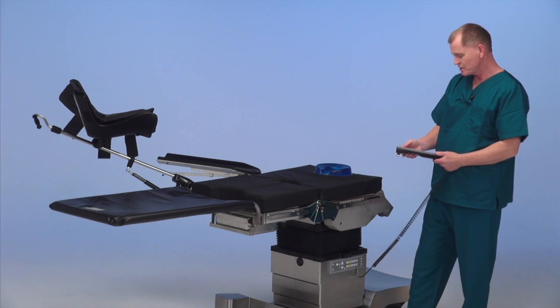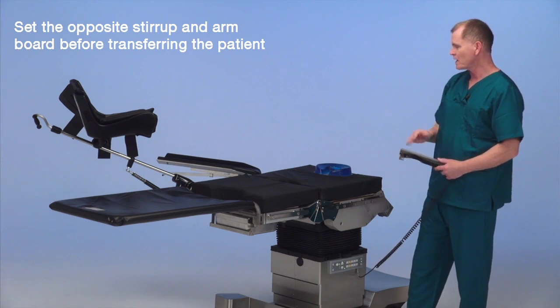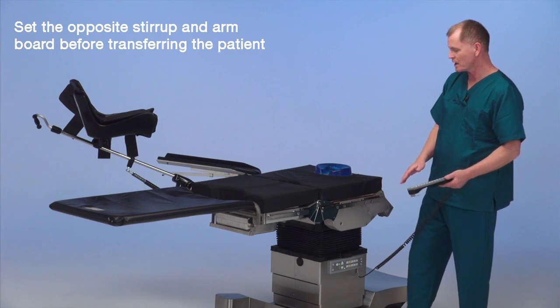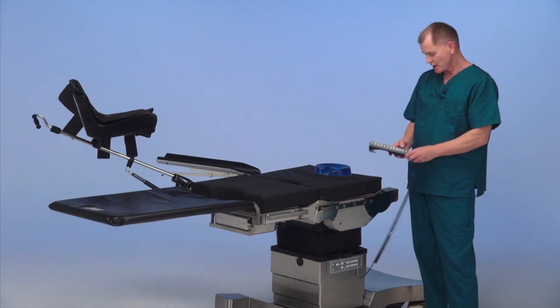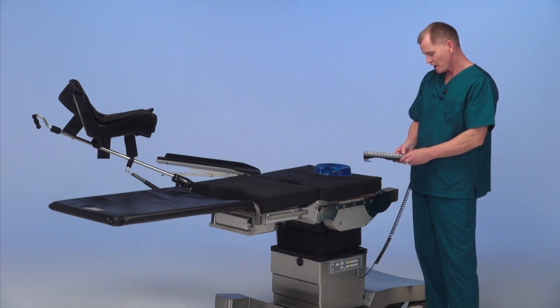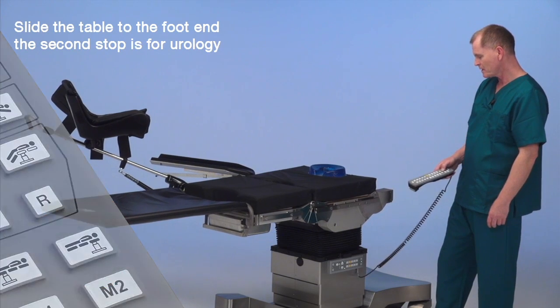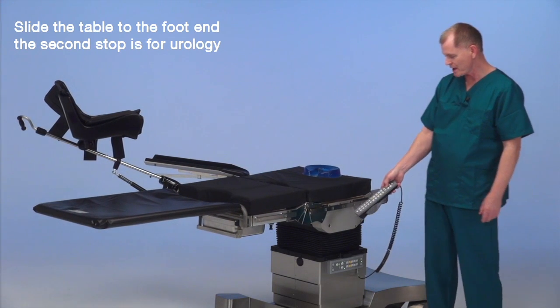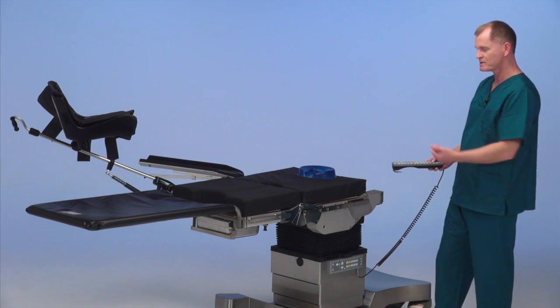We're going to have the armboard and the stirrup on the non-transfer side of the table ready to go. This being the transfer side of the table, we turn the hand control on and slide the table to the foot end to clear the column and the base so that we have access up into the kidney area.